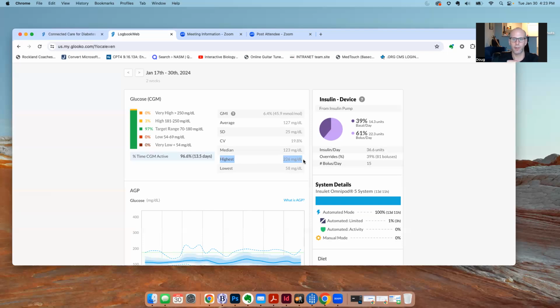And so if you're always aggressive, but then you don't have such an intense workout, you're going to be a little bit high. But for me, I personally would rather be a little bit high than a little bit low. This is just where I would recommend people just play with it. You always want to take sugar before you're going to do a workout like this, but how much and the timing of it is something that you want to tweak and try different things about. So yeah, I would encourage anybody to play with this. And again, let me know in the comments if you're having trouble with this. We can try to brainstorm it.